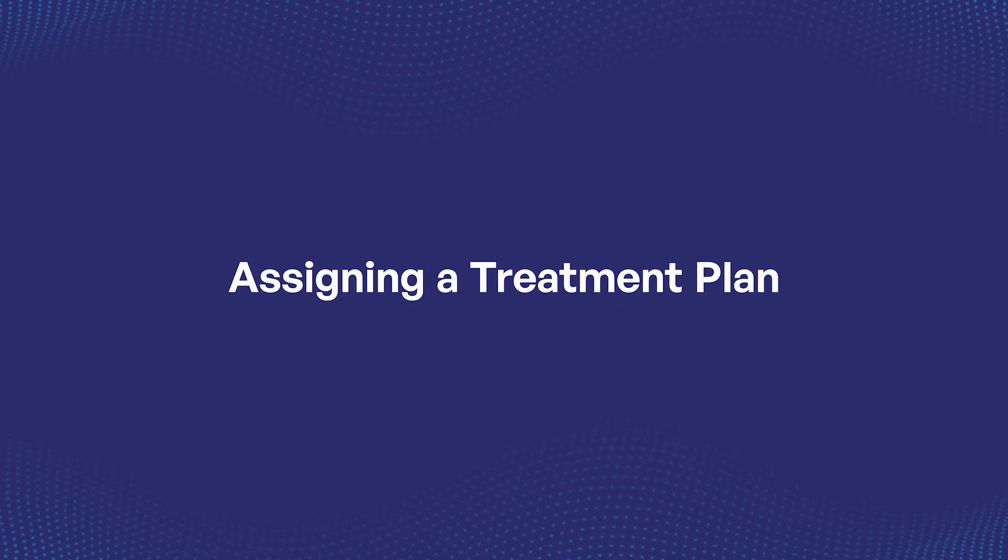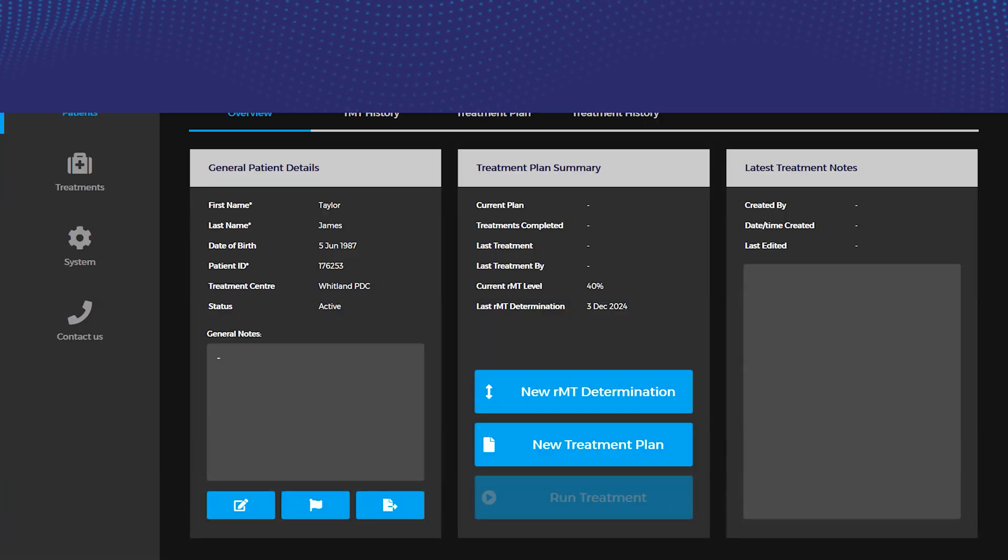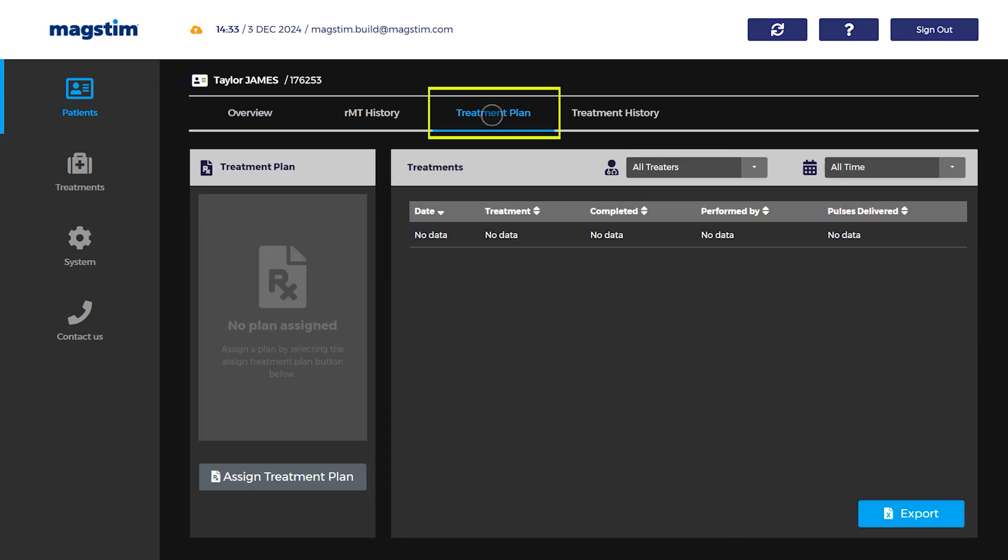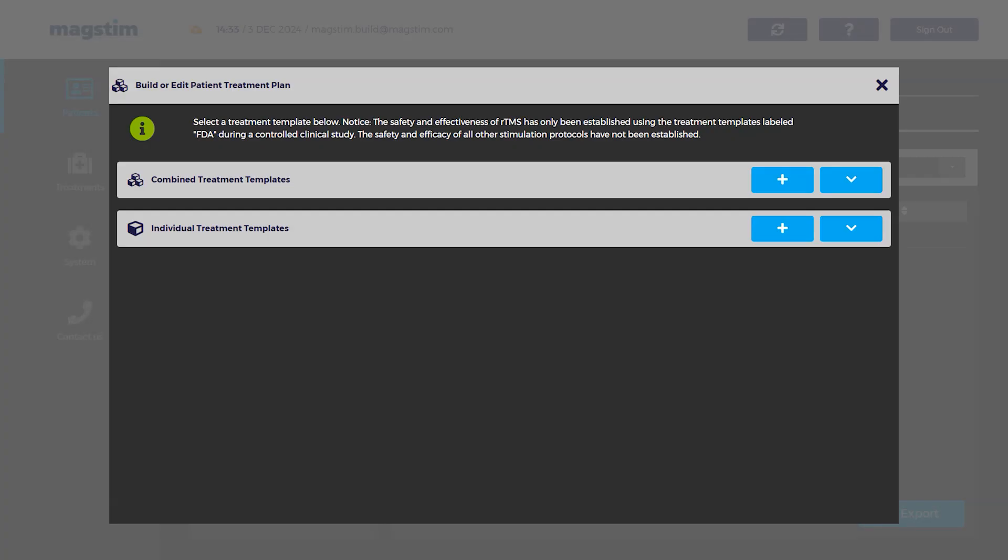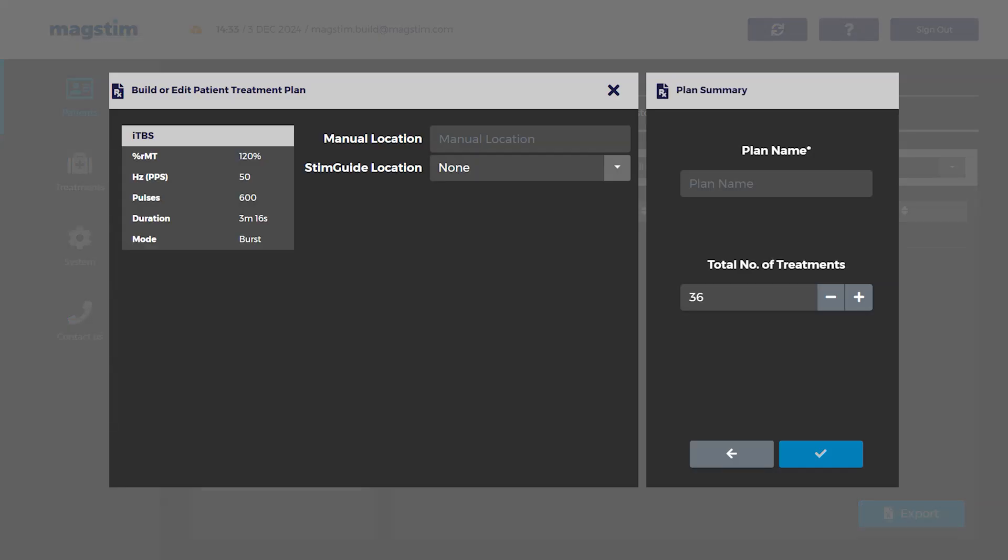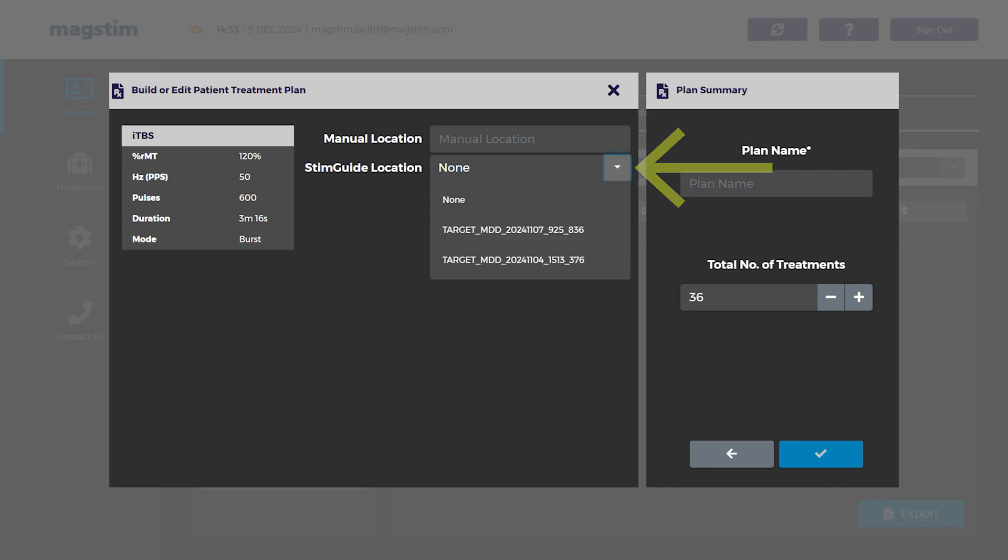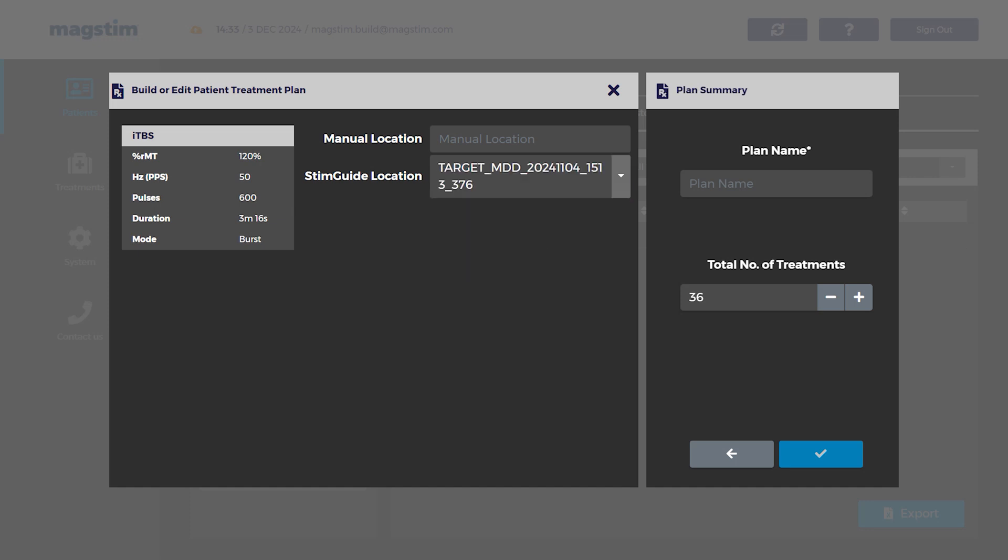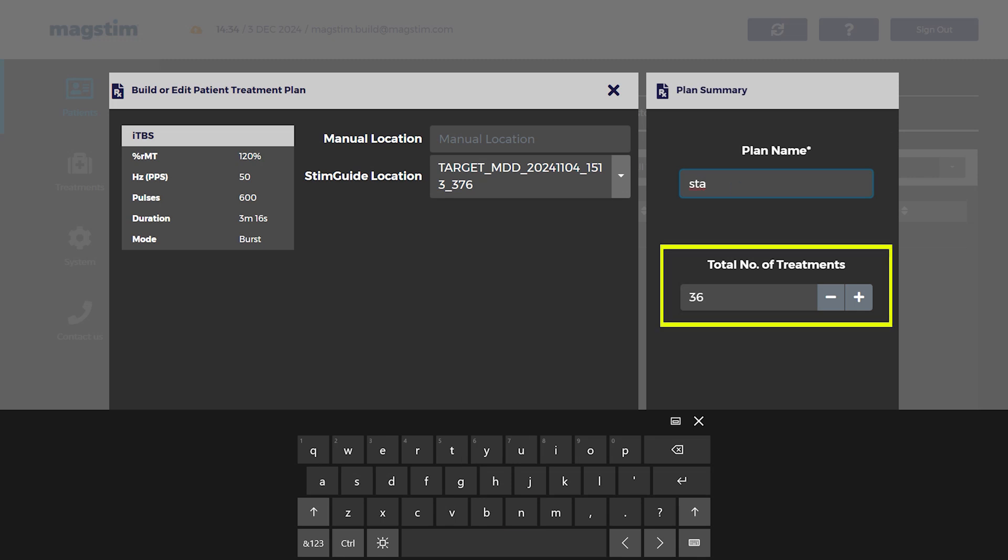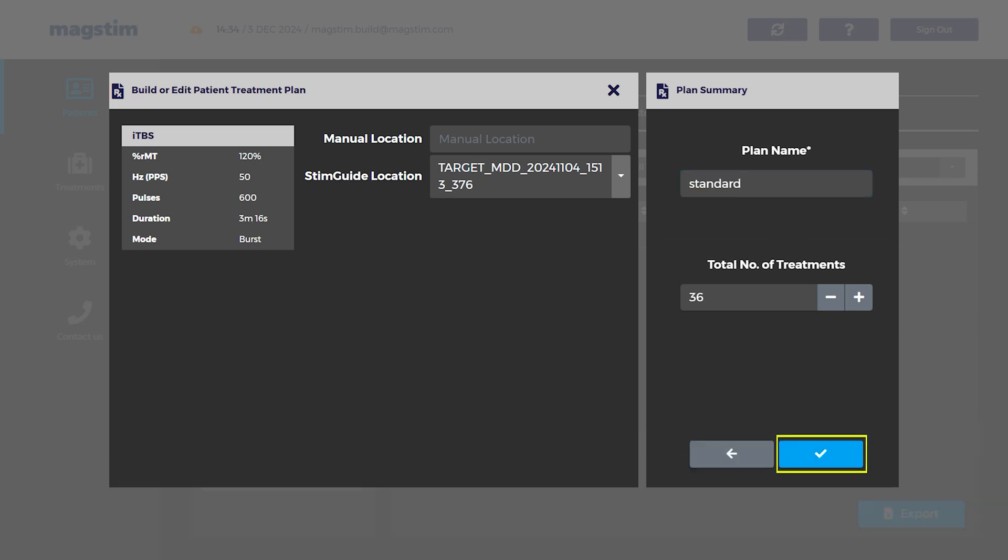Assigning a Treatment Plan: A treatment plan is the assignment of a treatment protocol. Before beginning, complete a motor threshold determination and register the treatment location. On the patient record, within the Treatment Plan window, select Assign Treatment Plan. Press the Expand icon to expand the individual or combined treatment lists. Select a combined or individual treatment template from the drop-down box. Use the Stim Guide Location drop-down box to select the correct treatment target. If no name was associated to the target, its preset name will contain the date it was entered. Enter a name for the plan, for example, Standard. Enter the number of treatments and select the check icon to save the treatment plan.